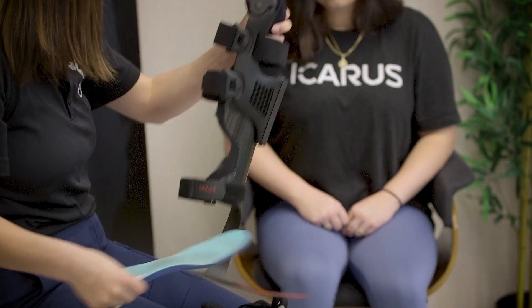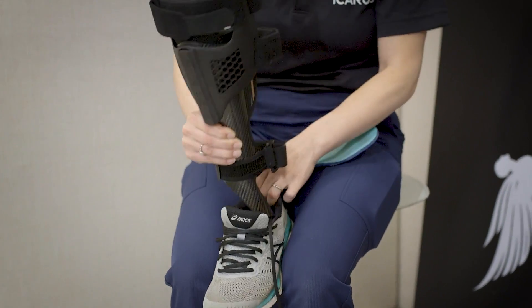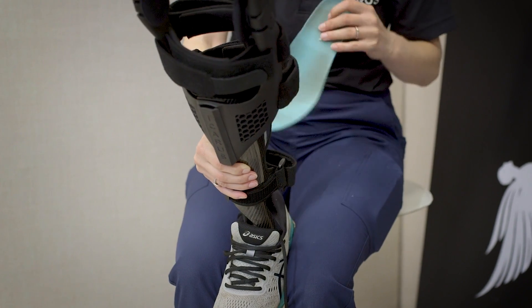Start by first placing the AFO portion into the patient's shoe. Adjust the AFO footplate length as needed with the proper tools. Cover the footplate with the patient's shoe and insole liner.